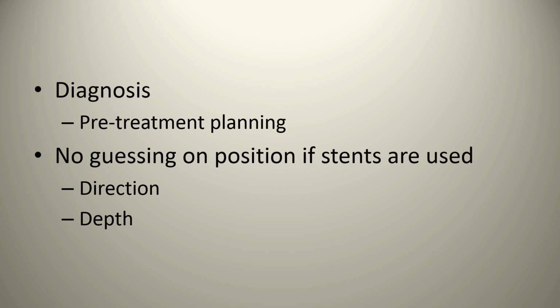And I may add here that when you say there's no guessing on position, remember that the ultimate gauge of placing an implant inside a patient is actually working on a patient. Even with stents, there are error factors that are introduced, and the absence of experience or skill on the part of the clinician will not be made up simply by having a cone beam CT and some sort of lab-generated stent.